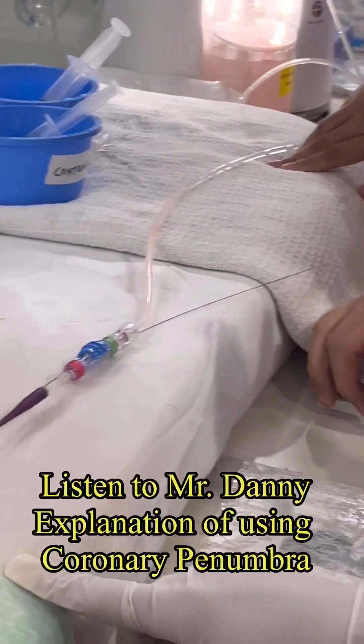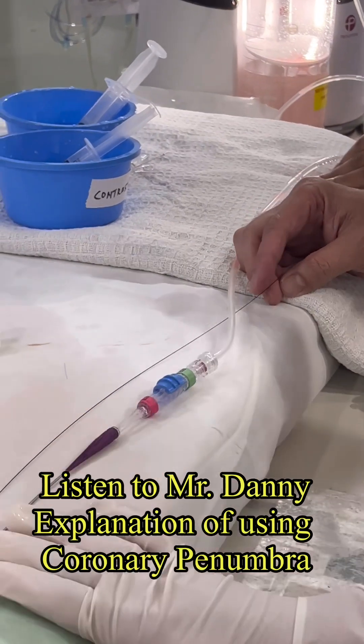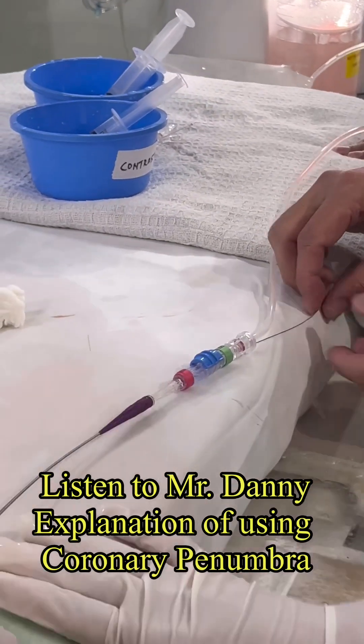This is just a hard model, so you might — it's not like the actual patient and all that, so there's some possible confusion and all that.